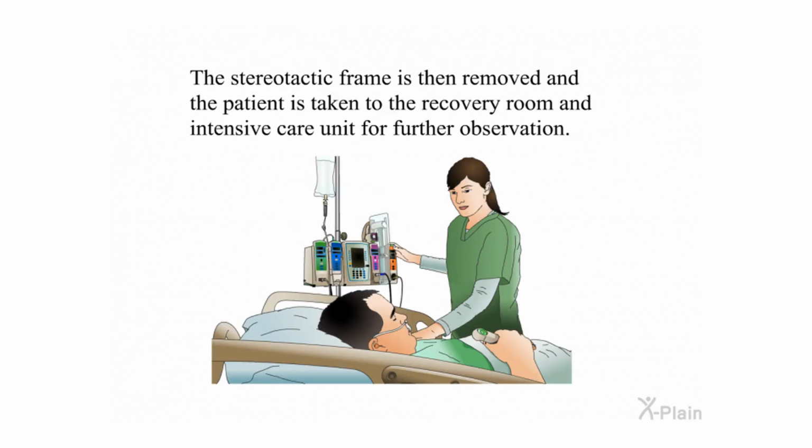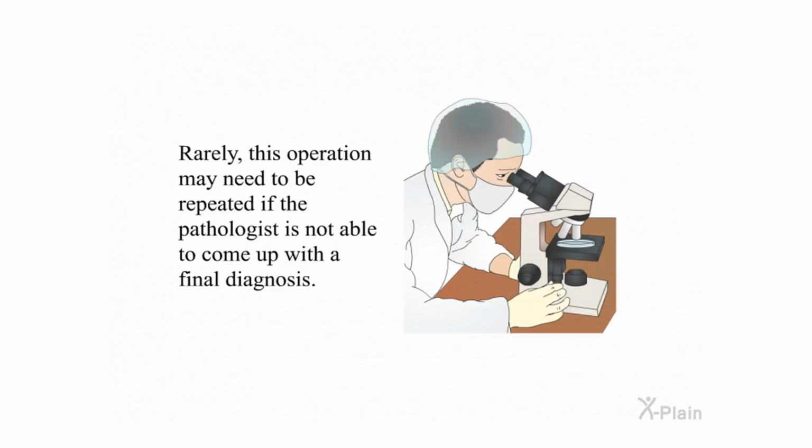The stereotactic frame is then removed and the patient is taken to the recovery room and intensive care unit for further observation. Rarely, this operation may need to be repeated if the pathologist is not able to come up with a final diagnosis.